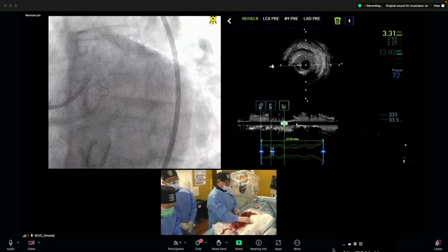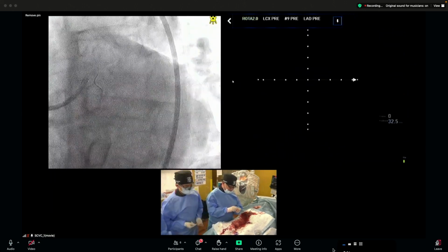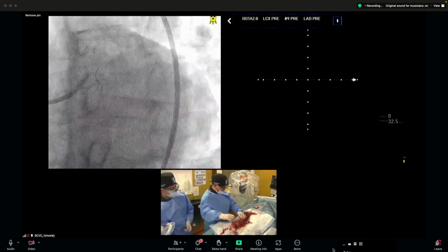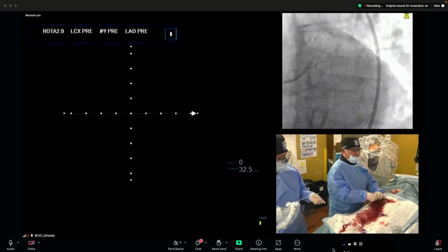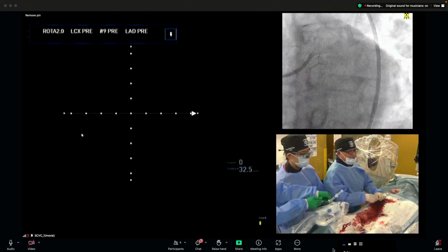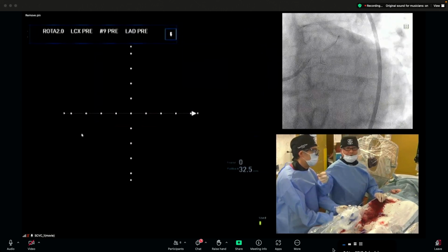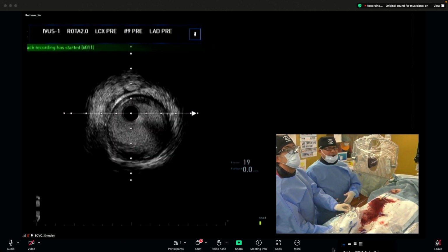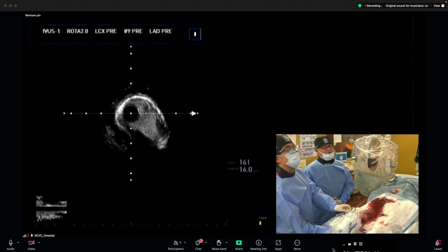Kashima sensei, if you don't mind, I think the panel as well as the audience are just surprised that you moved very quickly from 2.0 to 2.25. You started immediately with a 2 millimeter burr, you didn't start with a smaller size burr, and you went straight from a 2 to a 2.25. Yes, before the IVUS pullback. Before the procedure, without IVUS image, I think 1.75 is better as a first rotablation burr size.